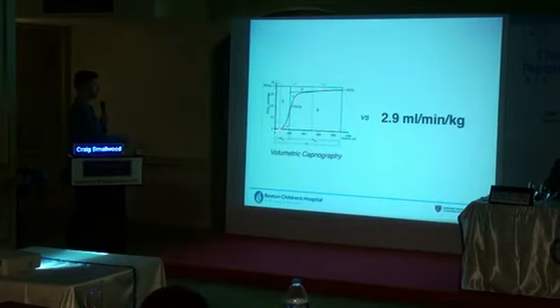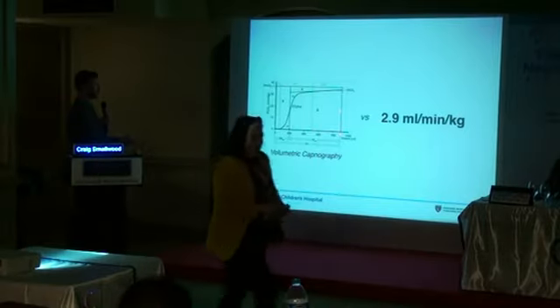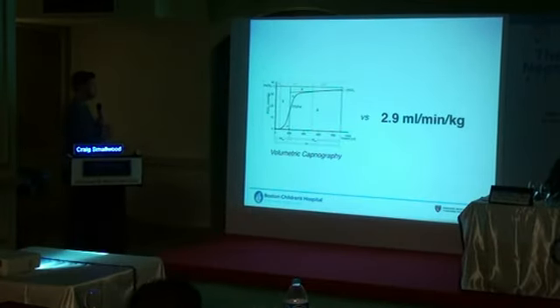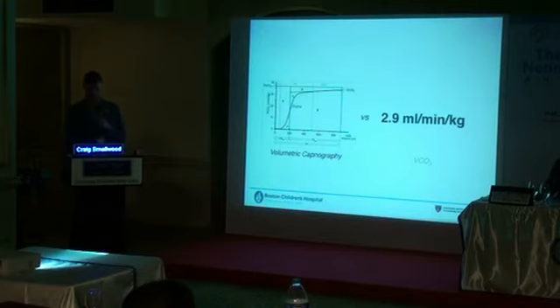And then basically from here, the volume is increasing. This is obviously an adult because this is a pretty big tidal volume, but dead space gas here is 200 mLs. Then enough gas, 200 to let's say 900, is alveolar gas. What you can do is then calculate automatically on the ventilator the proportion of alveolar ventilation, which can be a helpful metric, as well as assess VD to VT, the dead space to tidal volume ratio.